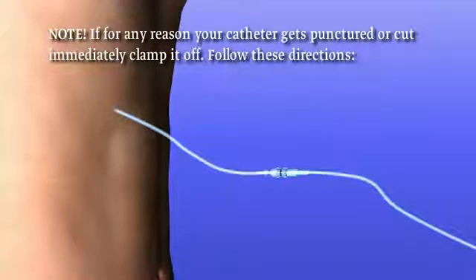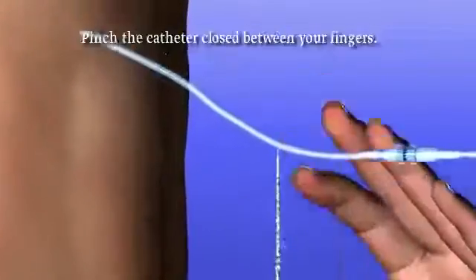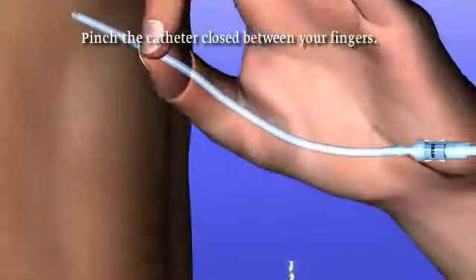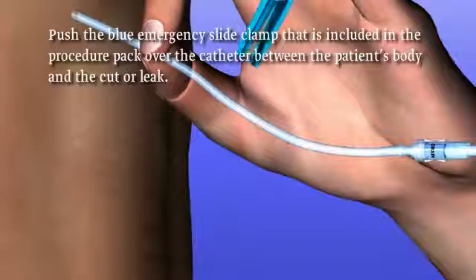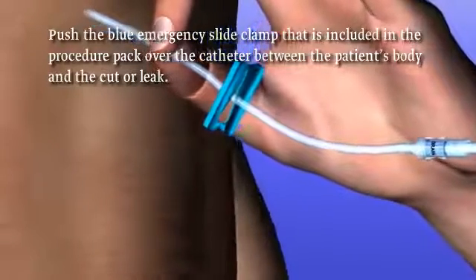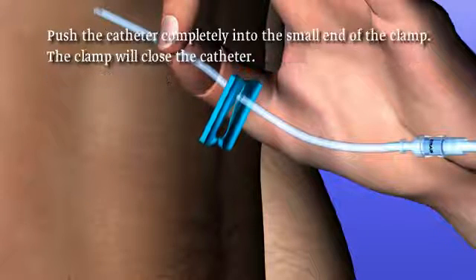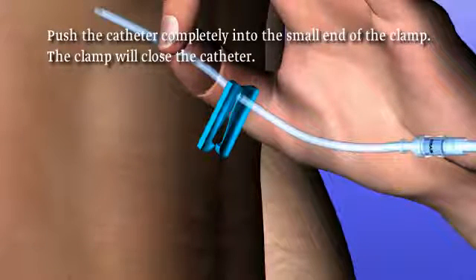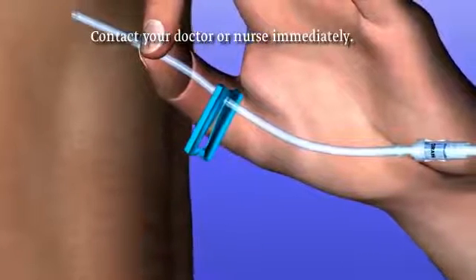Note, if for any reason your catheter gets punctured or cut, immediately clamp it off. Follow these directions. 1. Pinch the catheter closed between your fingers. 2. Push the blue emergency slide clamp that is included in the procedure pack over the catheter between the patient's body and the cut or leak. Push the catheter completely into the small end of the clamp. The clamp will close the catheter. 3. Contact your doctor or nurse immediately.